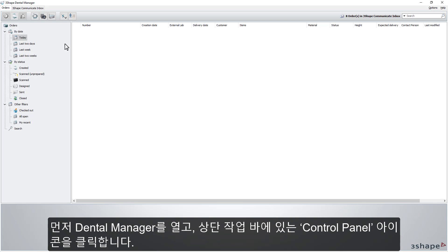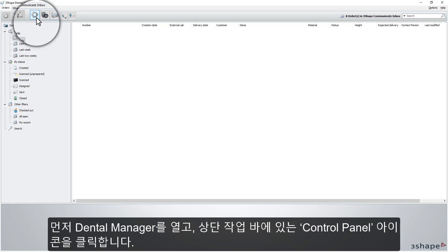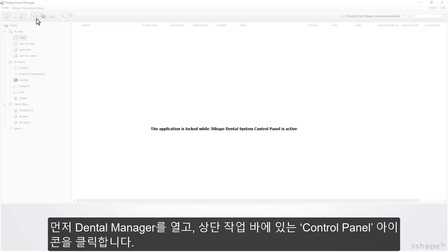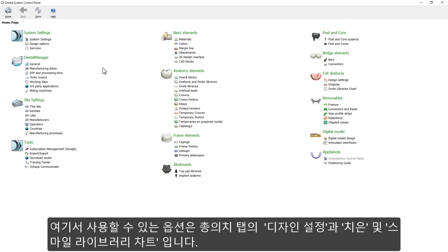When in the Dental Manager, simply click on the Control Panel icon in the taskbar. In here, we have a few options available for full dentures.